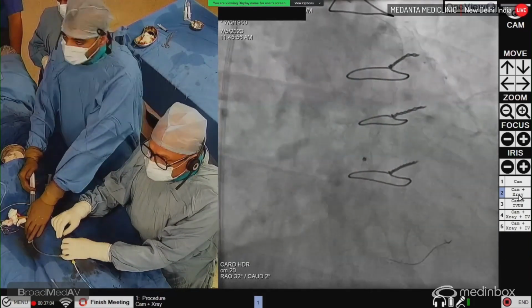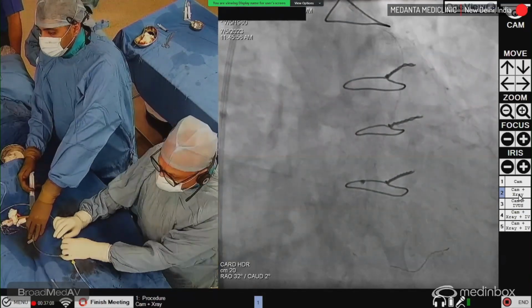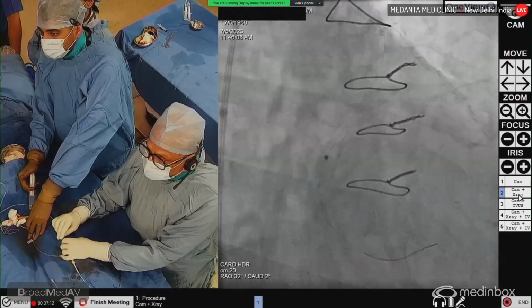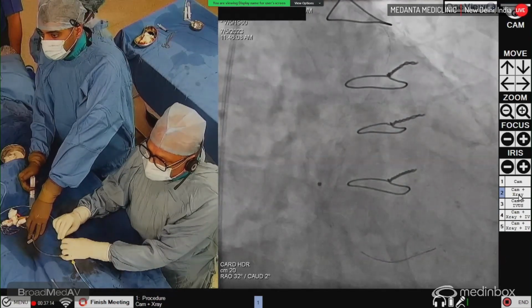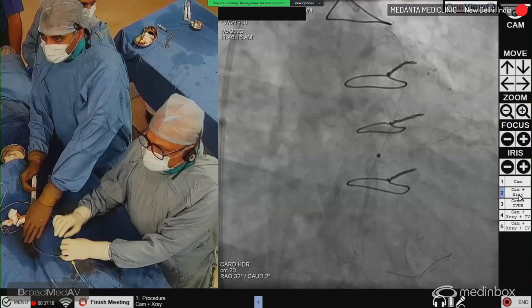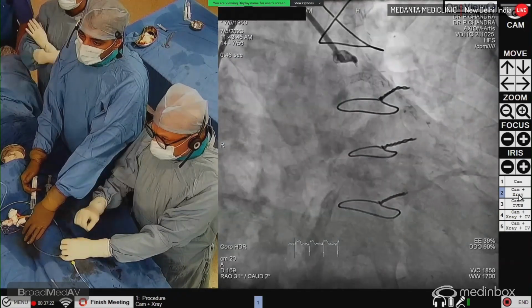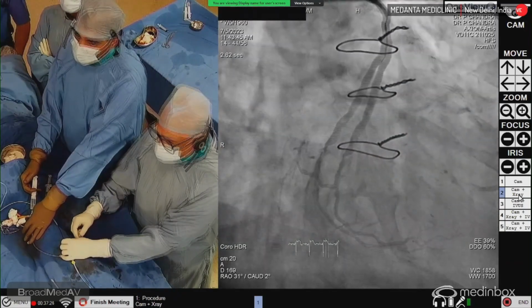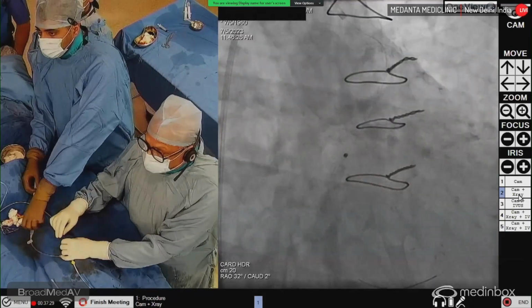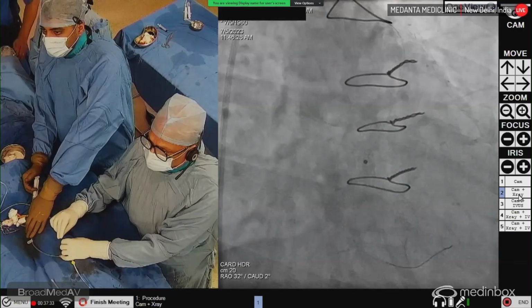Okay, ready? Ready. Flushing? Flushing. Okay. Ready. Please make it ready. So we switch it on to ready mode. Check please. Show me the last shot, please. So we'll use these wires as markers to know where we have to start and where we have to end, because we have not moved the table at all. So this is the starting point.